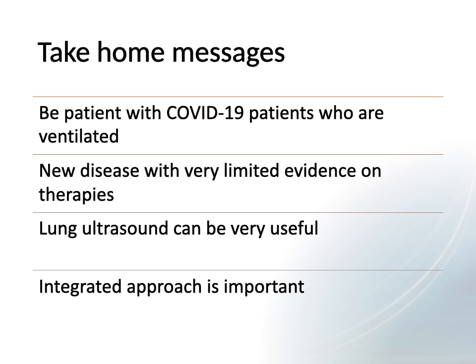It's a very new disease. It's a new disease with very limited evidence on therapies, but still we have good modalities that could be applied and integrated in our understanding and our diagnosis of this disease. Lung ultrasound can be very useful, and I would stress again on the importance of integrated approach in scanning these patients.